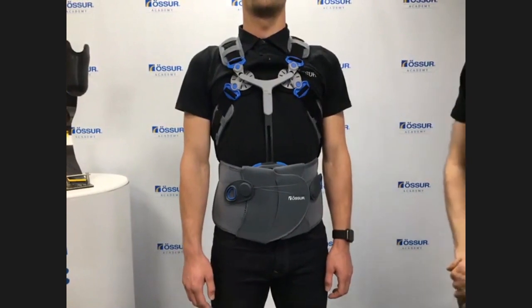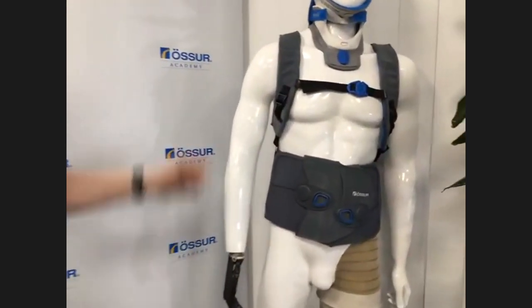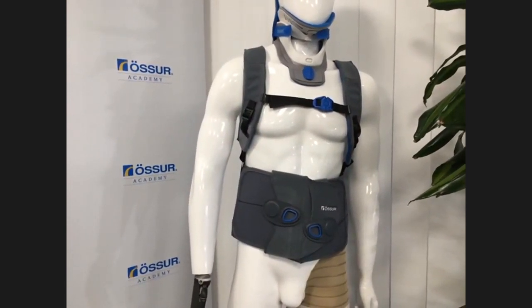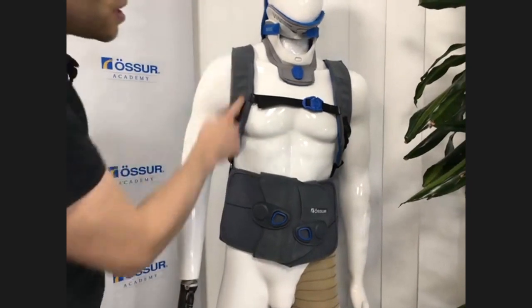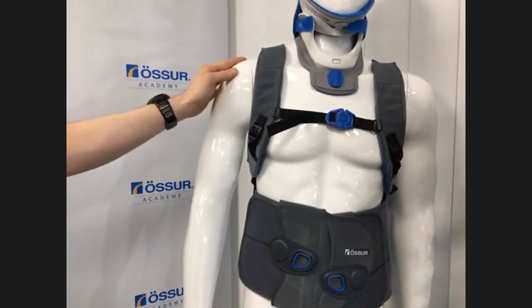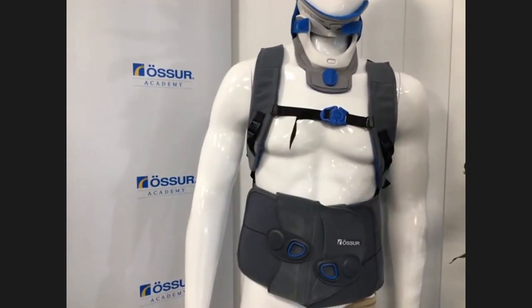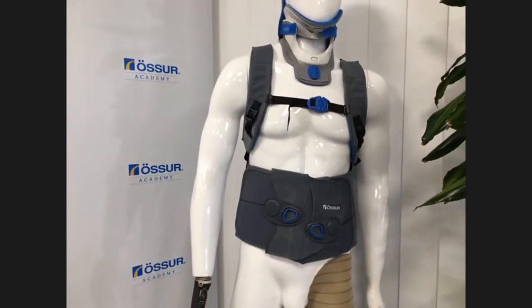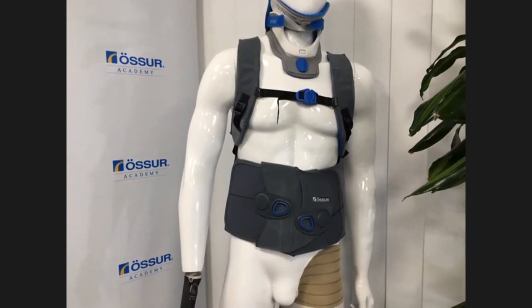Okay, so if we're then thinking about the other configuration, if we just come over to this side, we also have the option of having this configuration. So this is ordered as is, and is sized exactly the same according to a waist measurement, which then determines the size of the panel underneath. But you can see this is configured very similar to a rucksack. We have an adjustable chest strap either side just to adjust that and keep that in position. And this also means that the two shoulder straps don't separate and apply lateral pressure to the shoulders. So this can be particularly useful if the patient has sternal involvement, or for example, if the patient is in quite a kyphosed position. It just means you're not applying pressure onto the sternum.